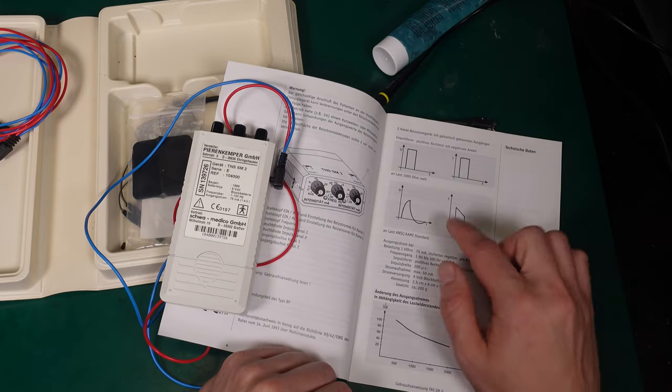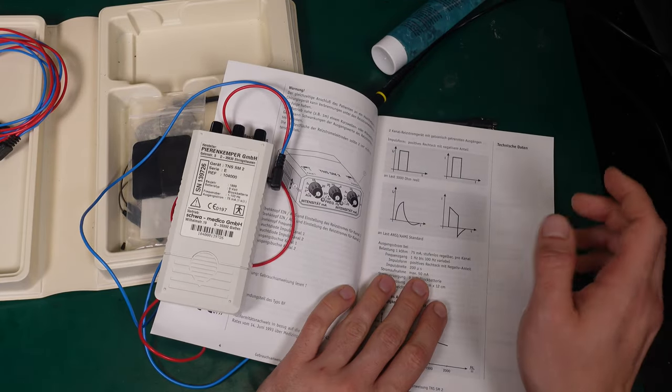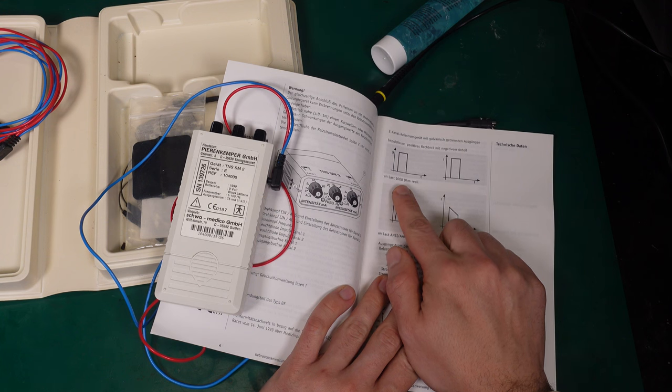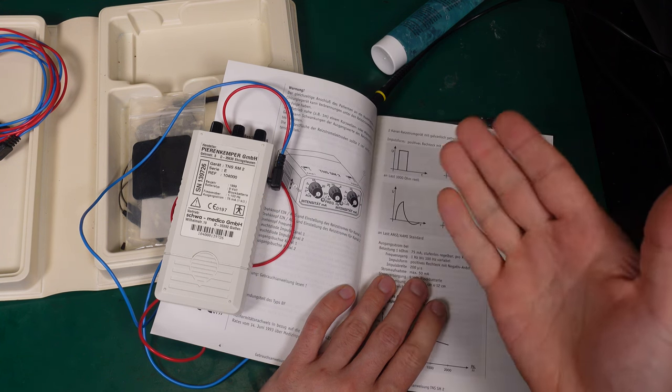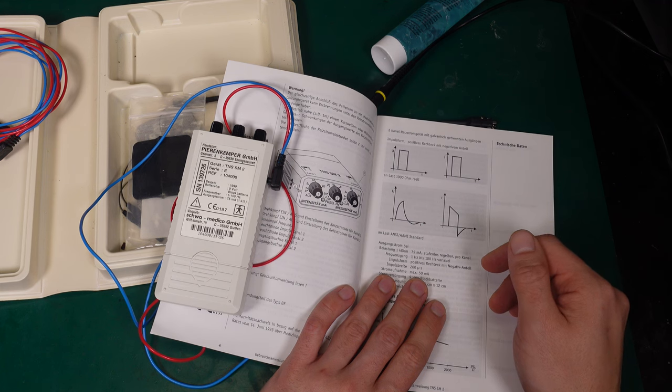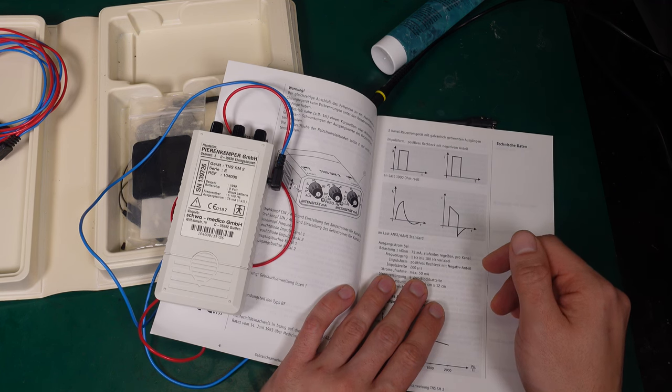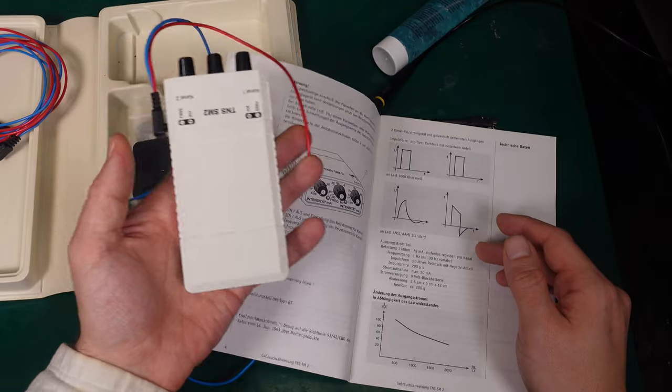As you were able to see, we are pretty close to the user manual. They are stating it is for a one kilo-ohm load. We are only loading this by my oscilloscope impedance, but we're pretty close.